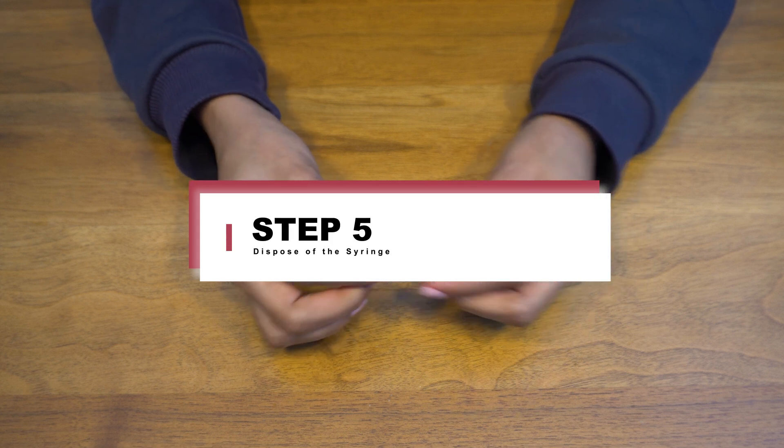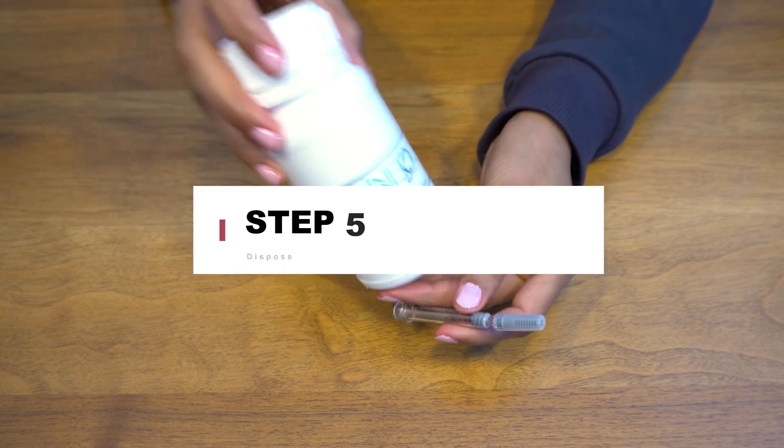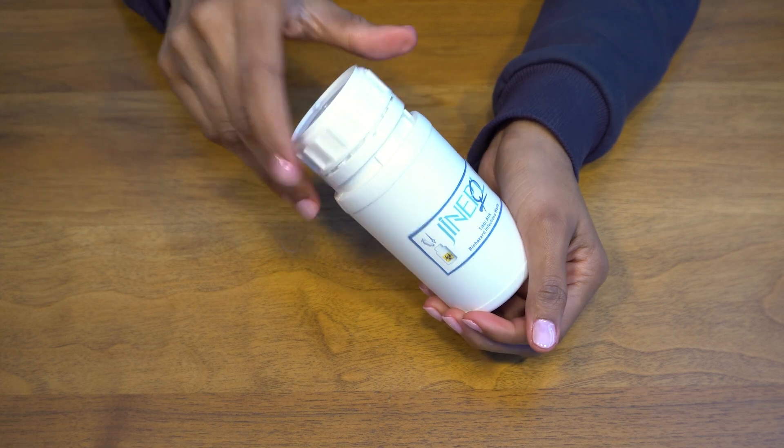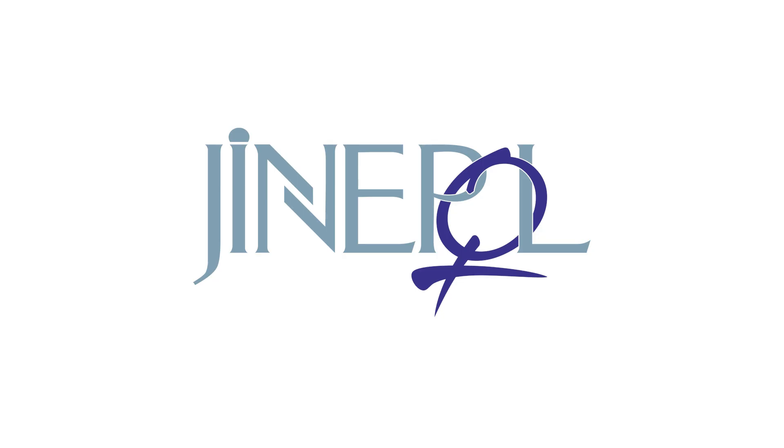Step 5: Dispose of the syringe and needle in a sharp container. Do not reuse syringes or needles. I hope this helps. If you have any questions, please contact us. Thank you.